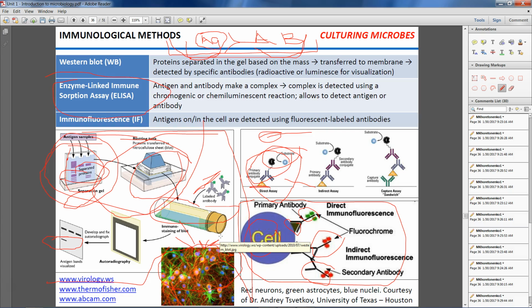You can put blood, sure, absolutely. You can put a blood sample and do fluorescent staining of the blood sample. So the convenience is that you can look for several pathogens at the same time. You won't be able to measure the exact amount of the pathogen, but you will be able to diagnose at the level of, does the patient have it or not? Make sense?